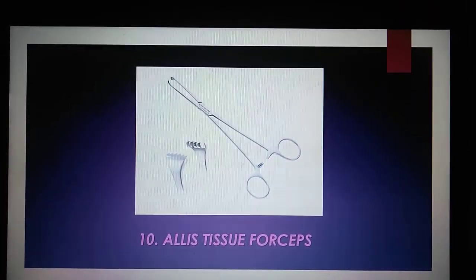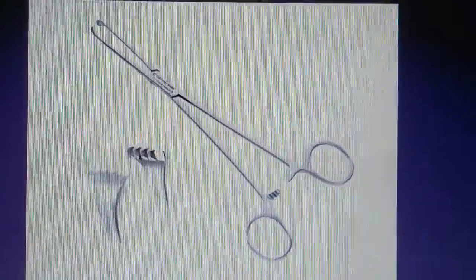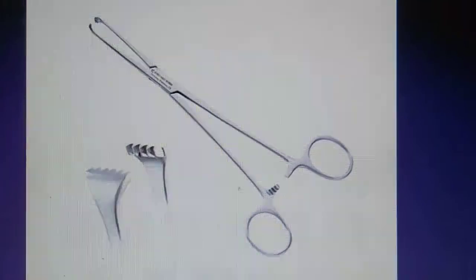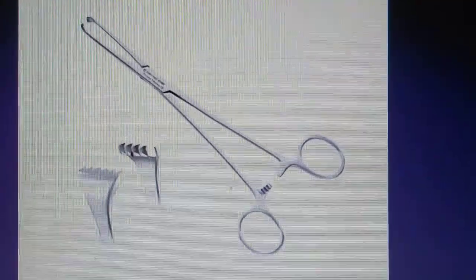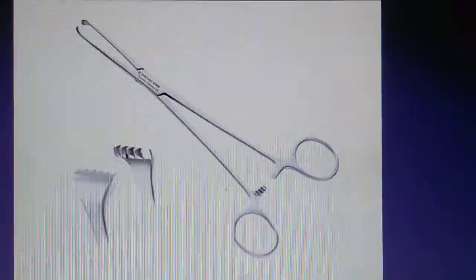Allis Tissue Forcep. This tissue forcep is used for firmly grabbing or holding body tissue during surgery. The teeth curve to the inside and may cause less harm to the tissue because of decreased general pressure applied to the area.